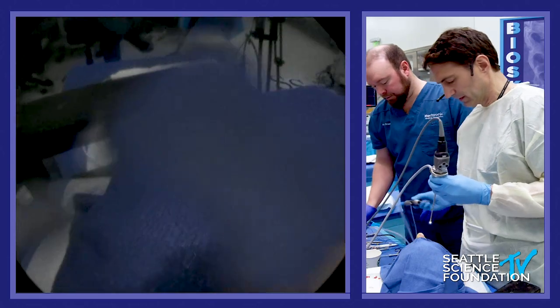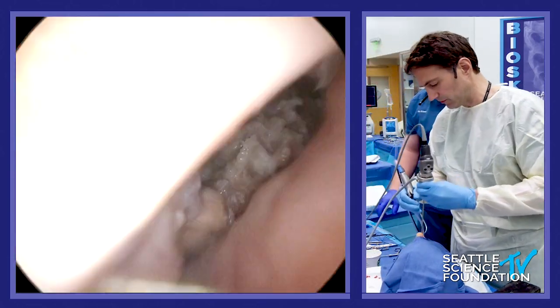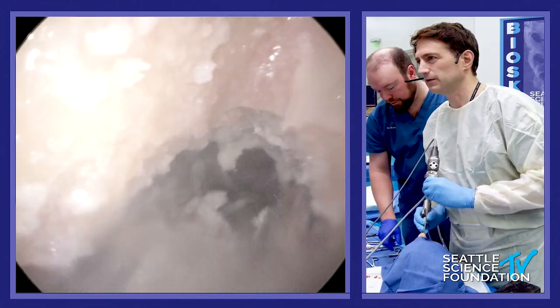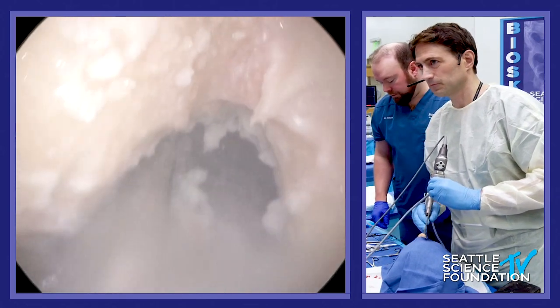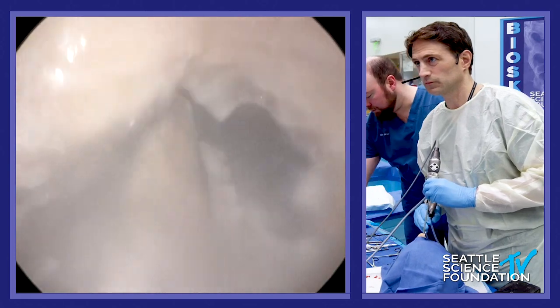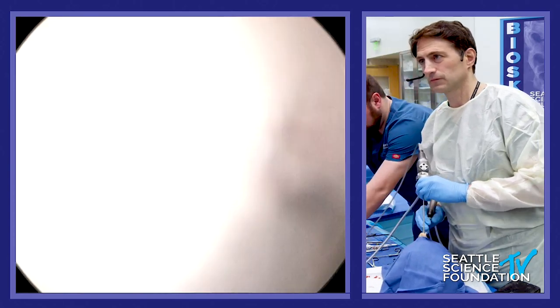Draft three. For the sake of time, I'm going to show you how to put the flaps up here in a second. There's probably still a little bit of bone I want to get down over here.